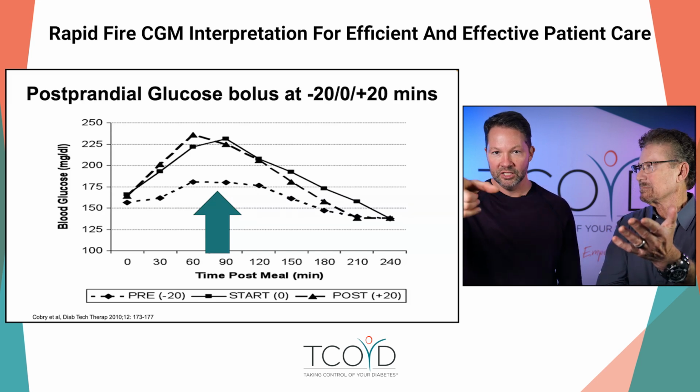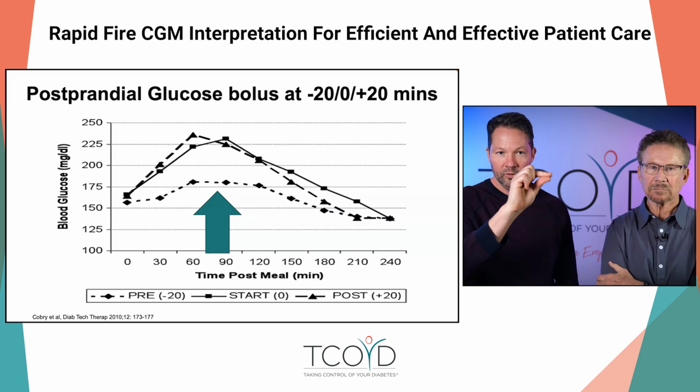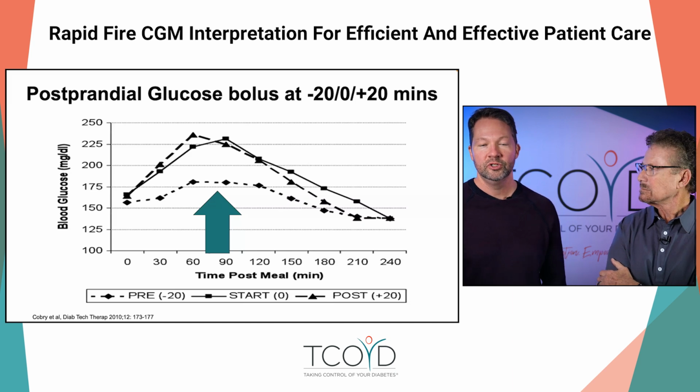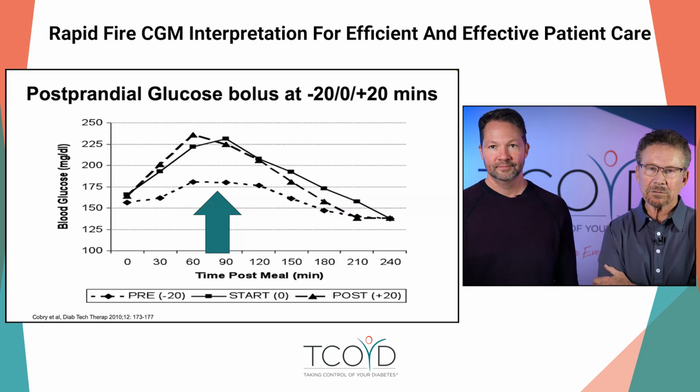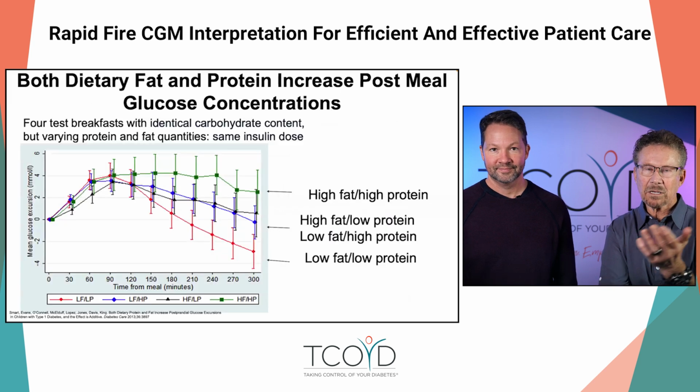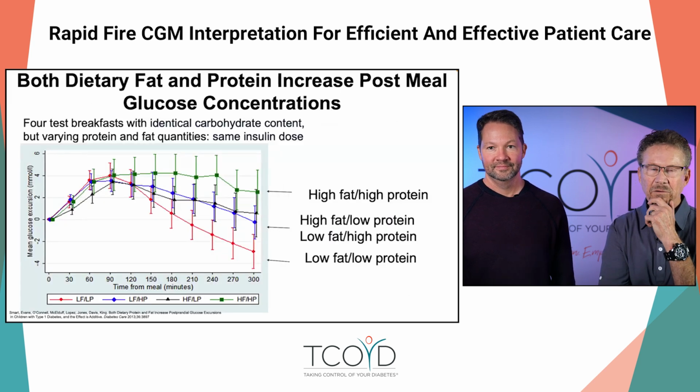It takes 6 hours. It just takes a long time to get there. Yeah. But in order to avoid that hour to 2 hour spike, it's more about timing than the dose. It's all about timing.